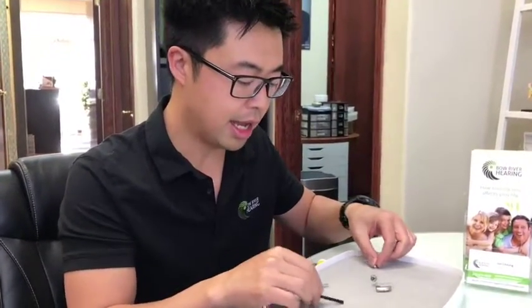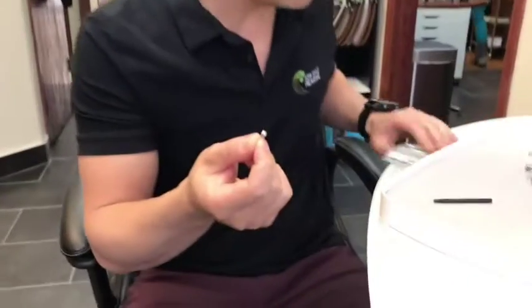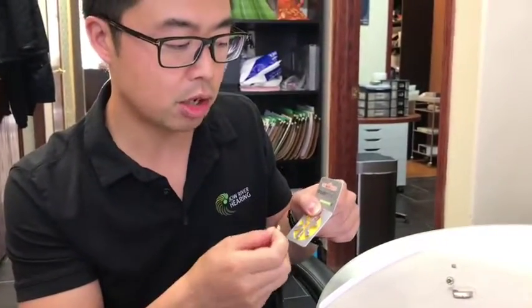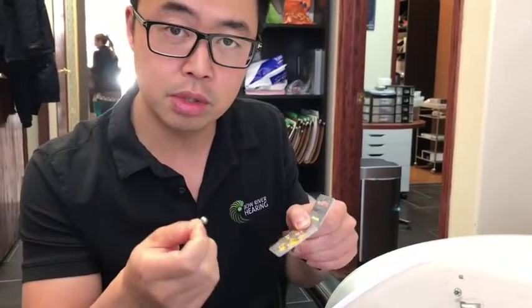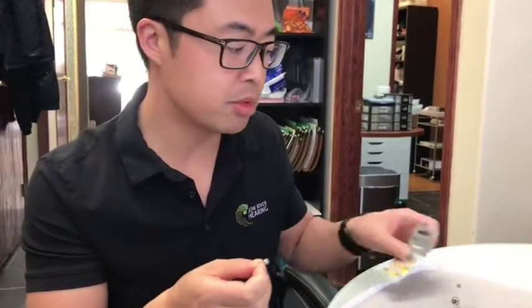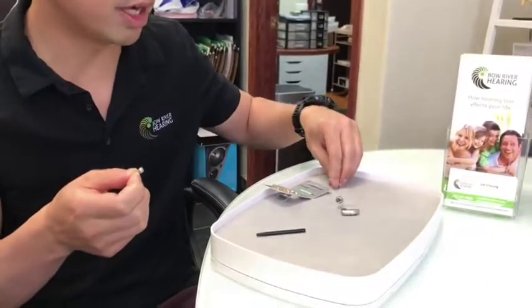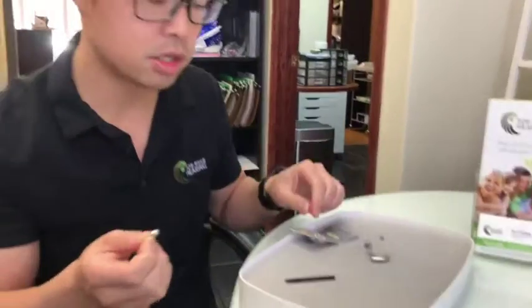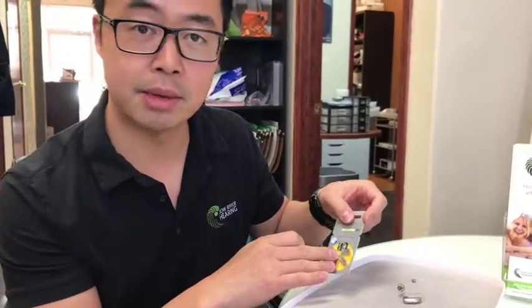Now what we want to do is put the new battery in. Another tip with these batteries is we always like to try to keep them in these cases, because we want to make sure they are separated from each other. Not only does removing the tab drain the battery, but sometimes when batteries touch each other they can begin to lose some of their power as well. So always try to keep them inside a case.